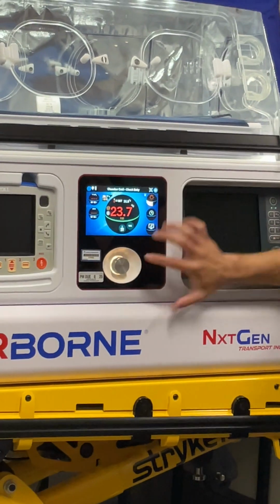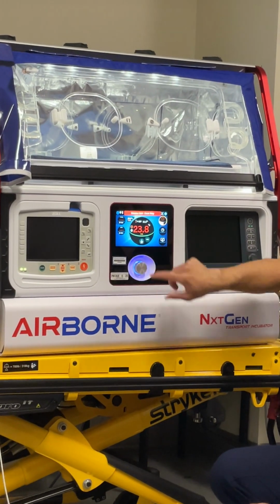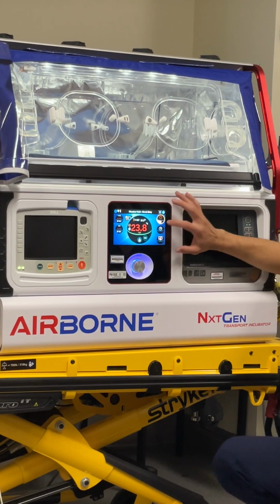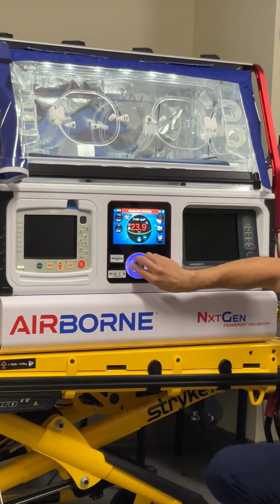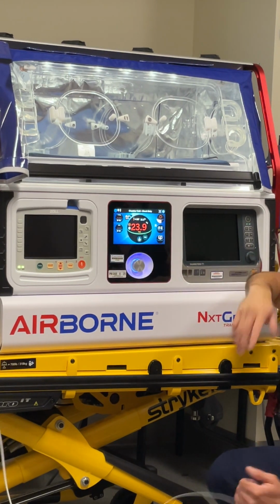This is a mixture of touchscreen and wheel. So basically I can use the wheel to go through the circles, but anything I need to change a numeric number, I need to use the wheel. So that's the observation light, stopwatch, and time countdown. Taskbar? Yeah, there you go.